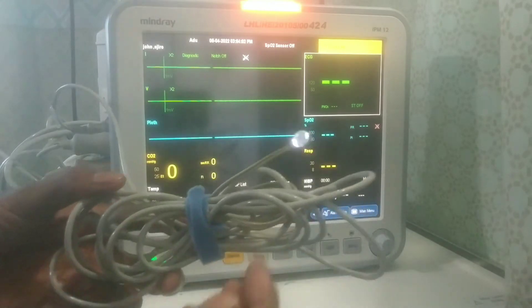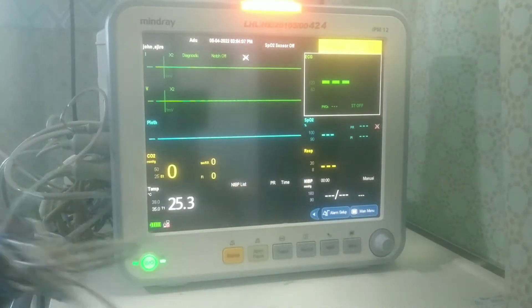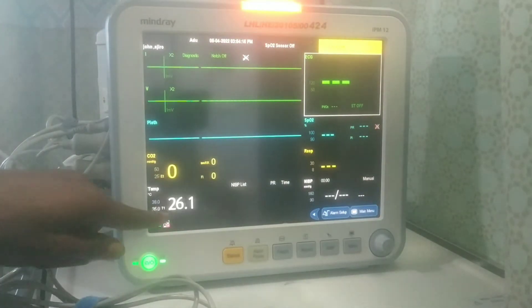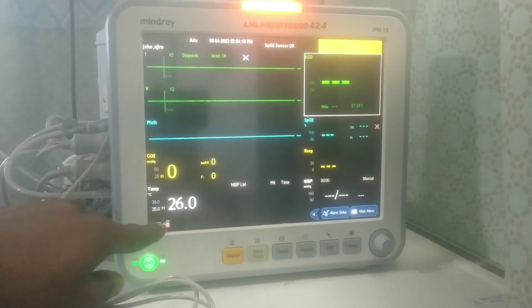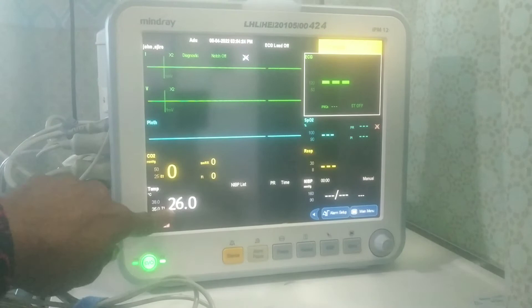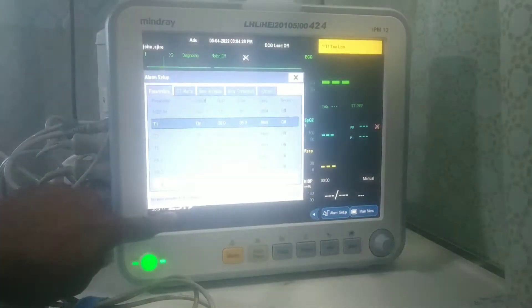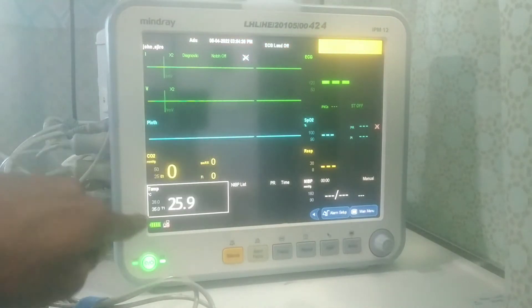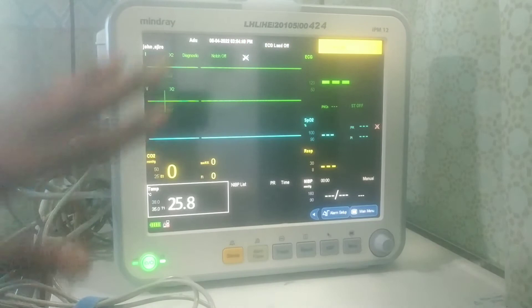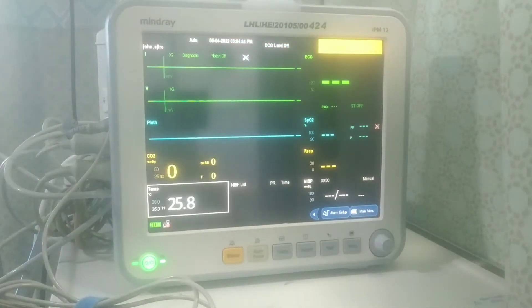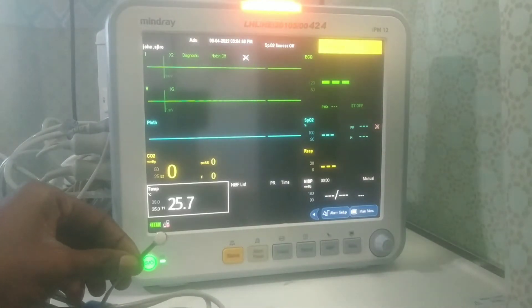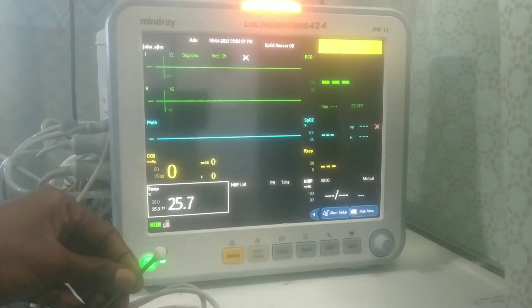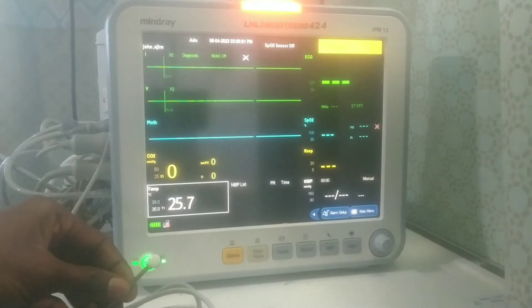Remember this temperature probe? This is where you connect to the patient. You can see this is where the temperature will be reading. Notice the number is decreasing — it will keep going down based on the temperature of the atmosphere because this probe is not connected to any body part. Once you connect this cable to any body part, it will automatically start increasing and reading the temperature of that body part.